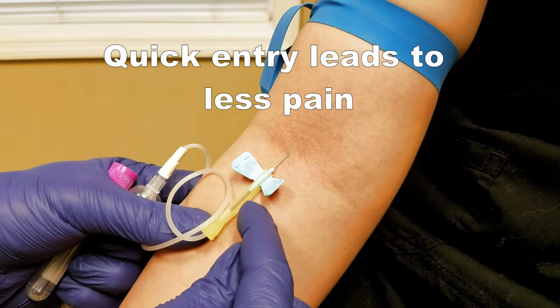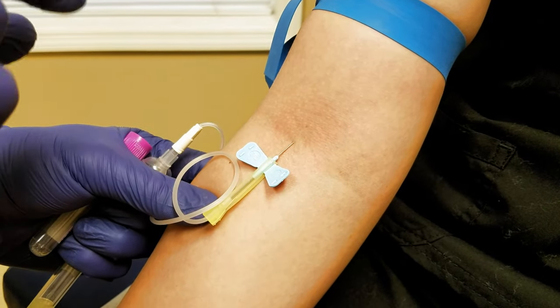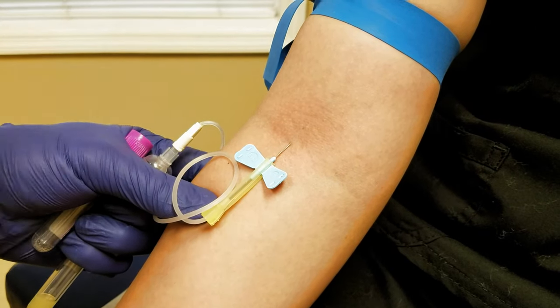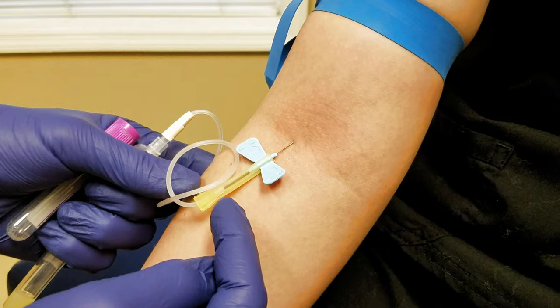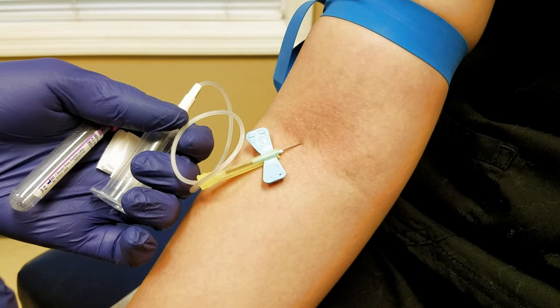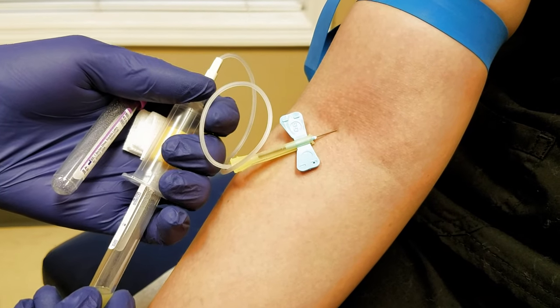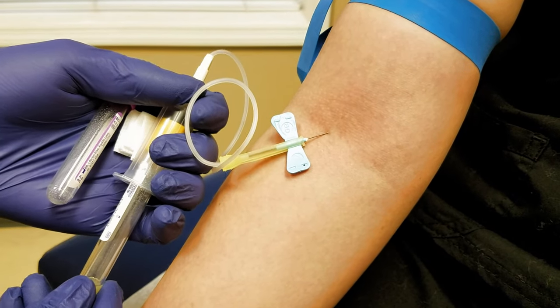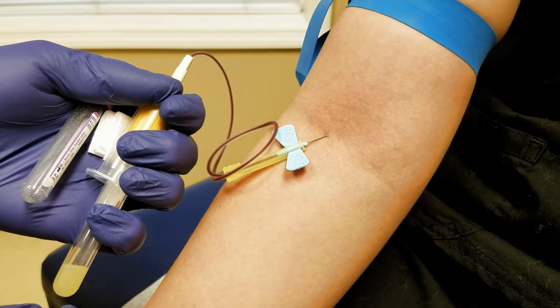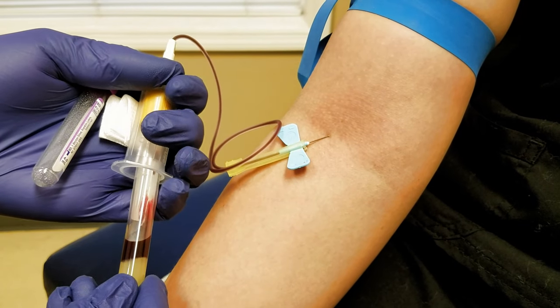You see a little bit of blood there. The goal is for the needle to be in the vein — you want to estimate where the middle of the vein is, because that's where the needle wants to be to get the best blood. You get a return here, and we've still got our vacuum seal on our tube. We're going to break the seal by pushing it on the little needle in the needle holder. As soon as we do, you'll see the tube fill up with blood — that's why these are so good to learn with.